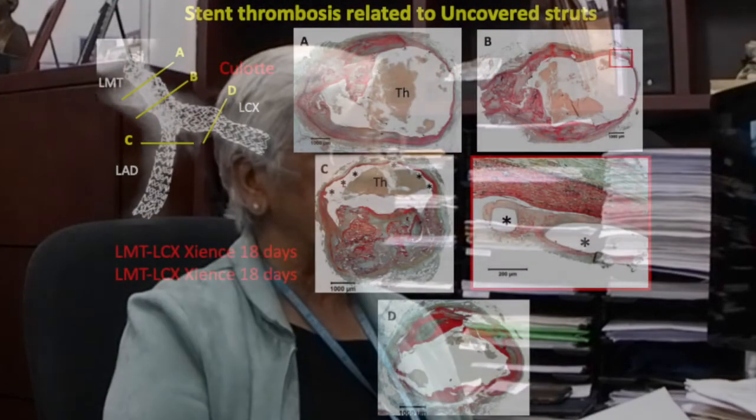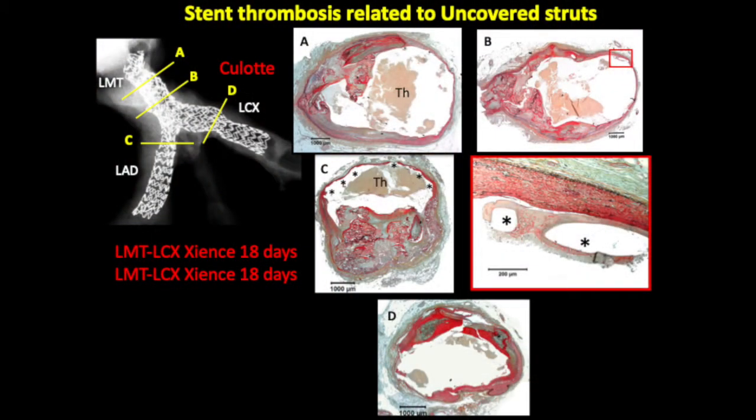Here is another example of uncovered struts that may also lead to stent thrombosis. The asterisks point to all the uncovered struts. This occurred 18 days after implantation in the left main, circumflex, and left anterior descending artery, and you can see the thrombus formation.